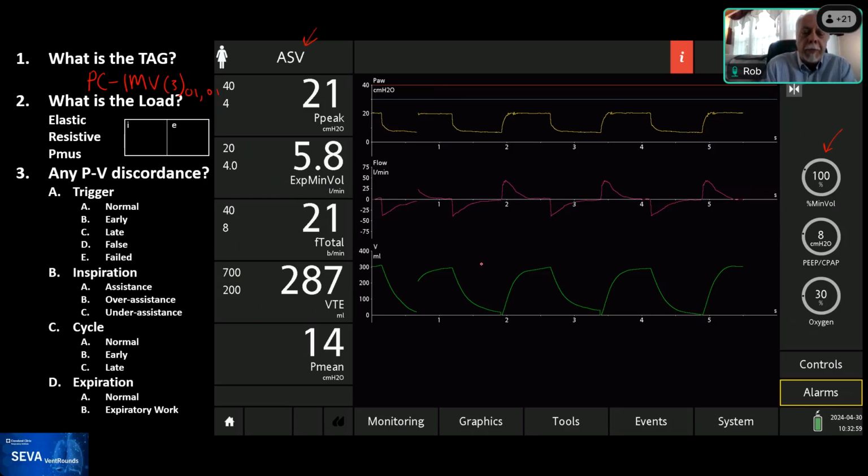So for example, the mandatory frequency can't be so high that the expiratory time is less than 3 time constants, because otherwise you're going to get gas trapping. And there are some other rules that prevent too high or too low of a tidal volume and things like that. So those are expert rules. Expert rules are tools from artificial intelligence. And so that's how you get optimal and intelligent all wrapped together.